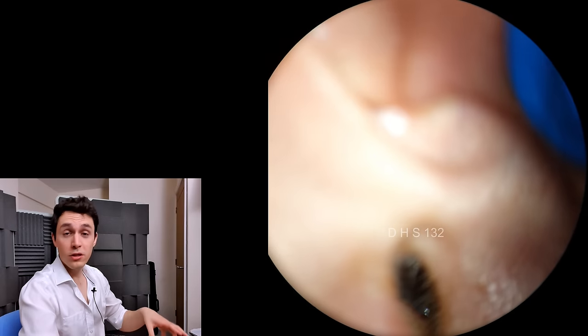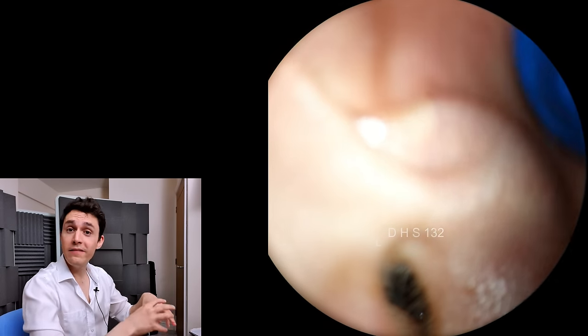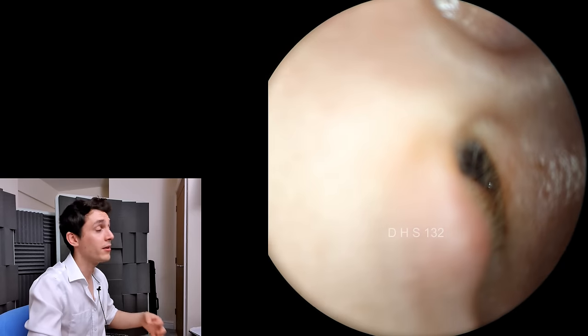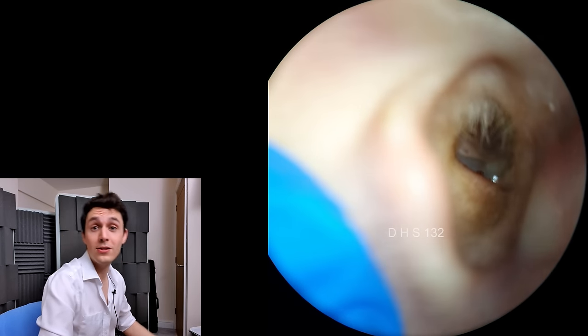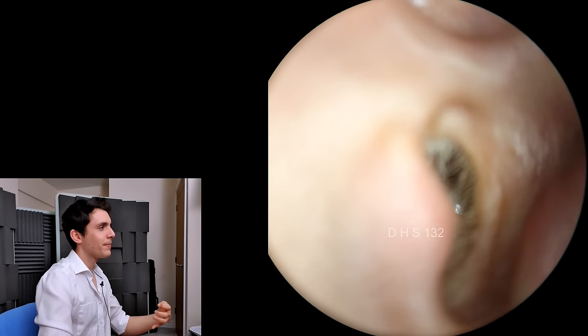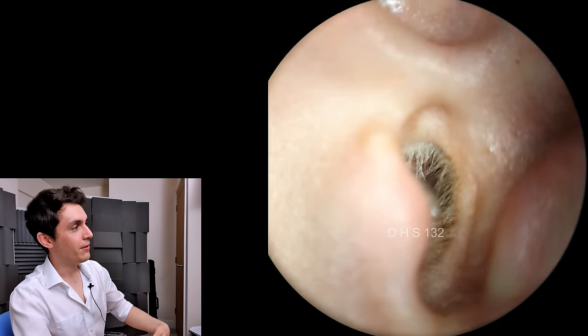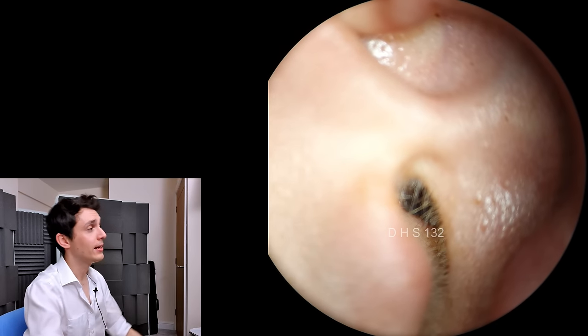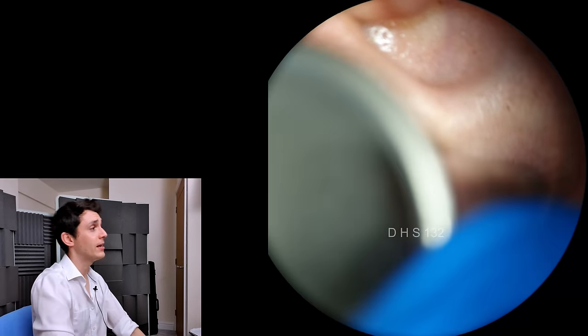In a perfect world, we want to achieve clearance, but we want to leave behind that little smearing or film of wax on the ear canal, because that's going to be better for the patient — it's going to defend them from infection. We want to leave the ear in a natural state of affairs; we don't want to wash the skin squeaky clean. And that's what we've been able to achieve here.